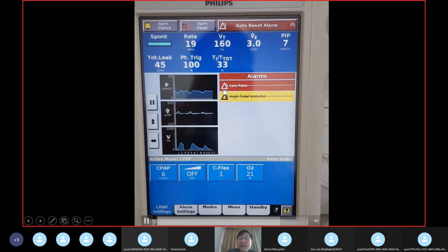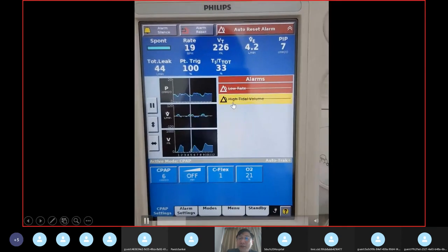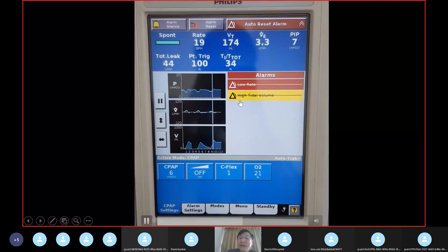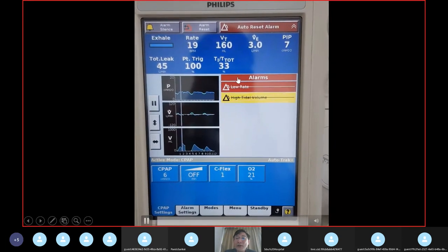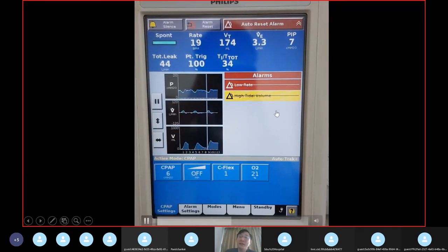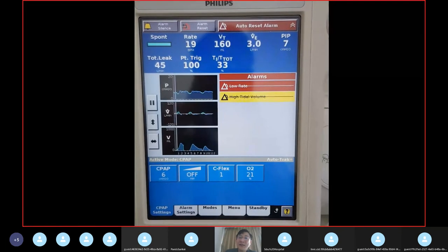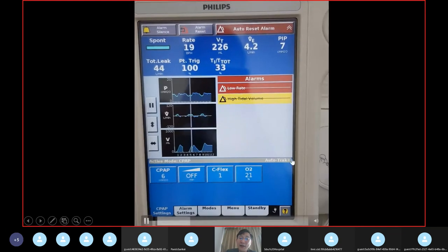Okay, and this column, if you have an alarm, the machine will come up with this alarm. Always look into the alarm and see what's happened, because we have had incidents where we thought the patient failed NIV. The patient looked very comfortable, except unable to maintain saturation, 70-something to 80-something. But then we put FiO2 very high.